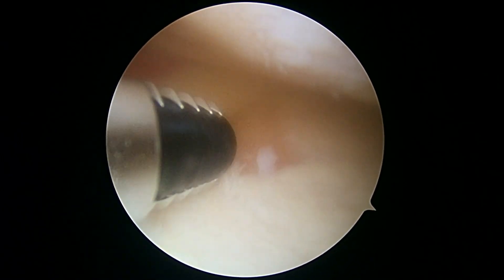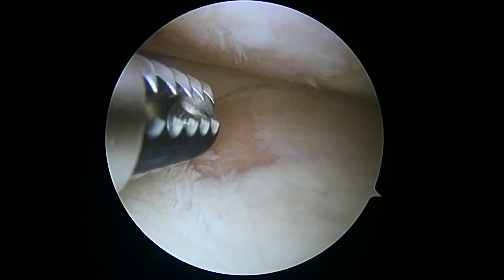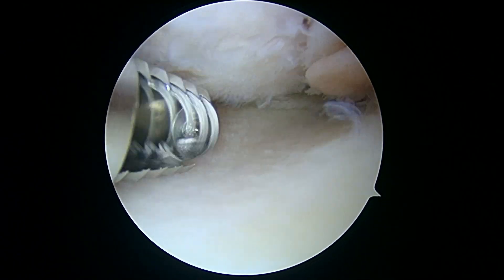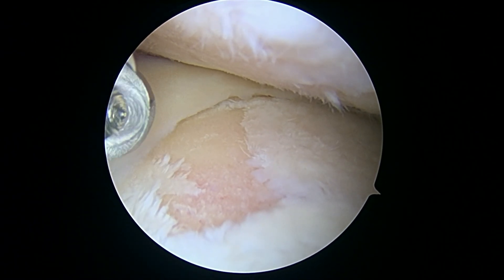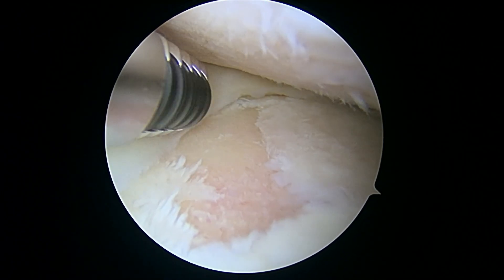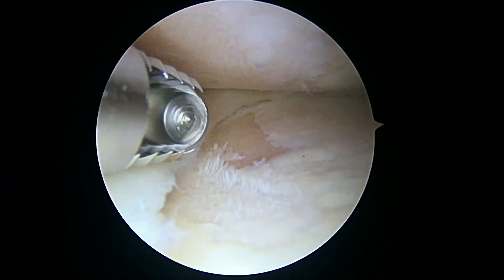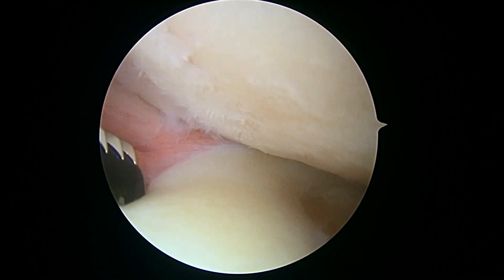We're just getting started on the left knee here. We've already got the bone marrow that we needed to make the bone marrow concentrate injection, and now we're just taking our first look in the medial compartment. This is the compartment where you have, at least by x-ray, the worst arthritic changes. You can see there are some areas of full thickness loss here on the medial edge of the tibial plateau. The cartilage is white, so when you start to see that yellowish appearance, that's subchondral bone. The meniscus above it looks okay, but when we rotate the camera and look up at the femur, we can see that you've lost cartilage here as well.